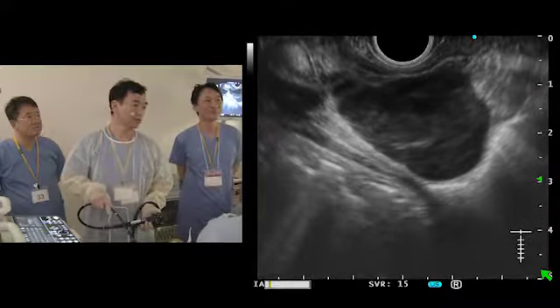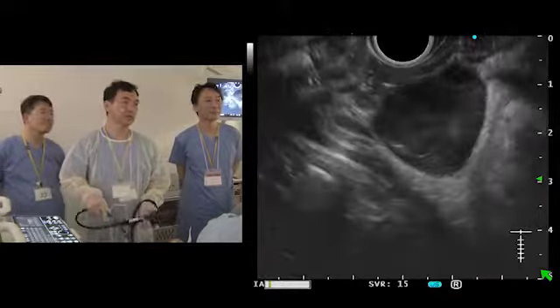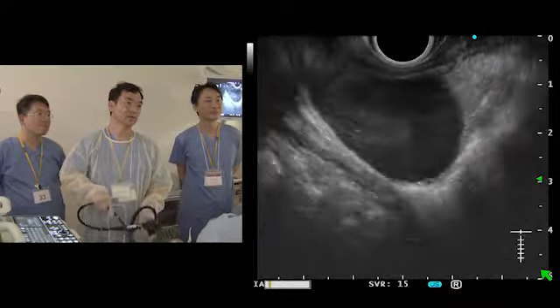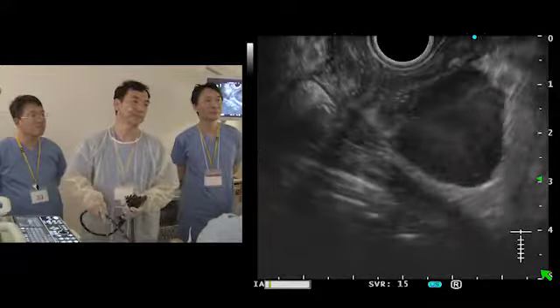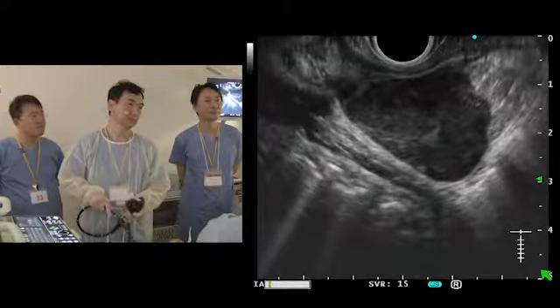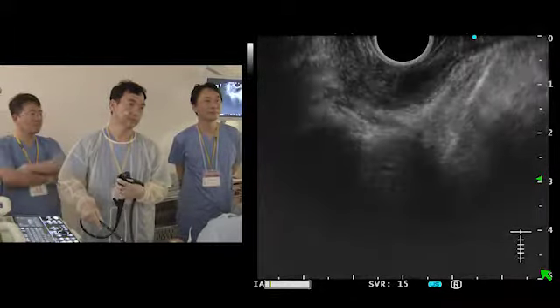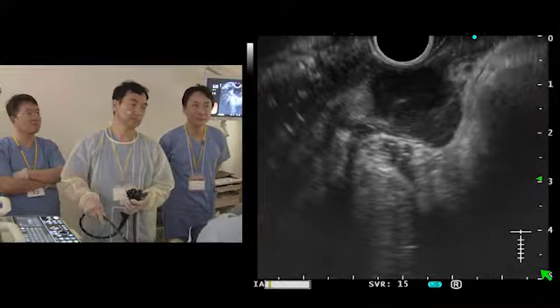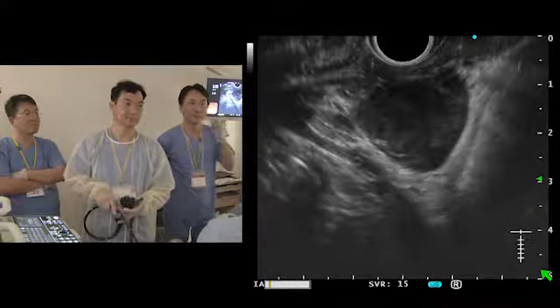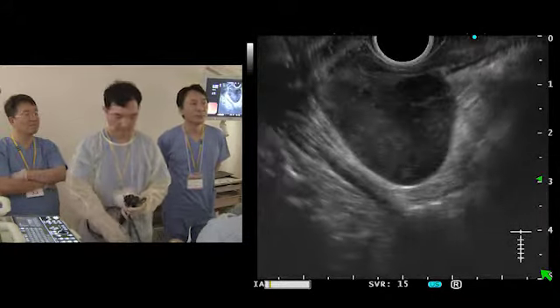Professor Inoue, would you comment? I mean, this is a rather exophytic growth. It's getting close to the heart, at this moment close to the aorta. We can recognize the fourth muscle layer close to our scope, and the tumor is an exophytic growth. So your report is right, but I think now the endoscopy pushes the tumor out.